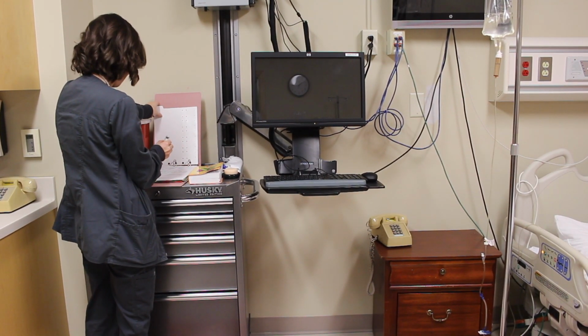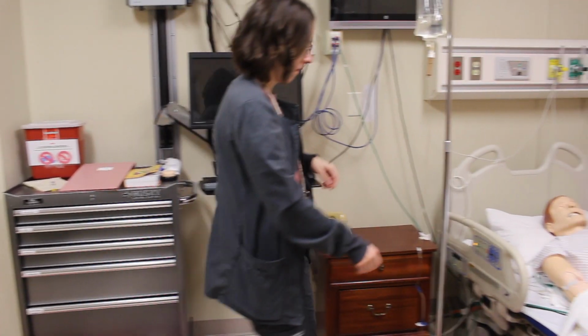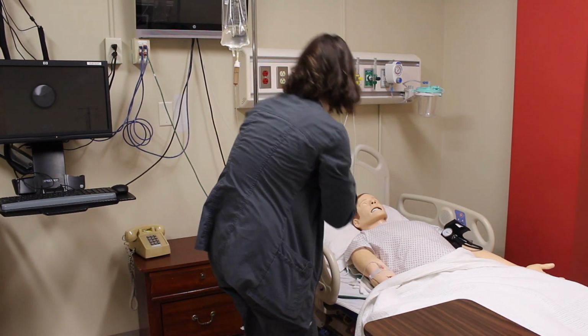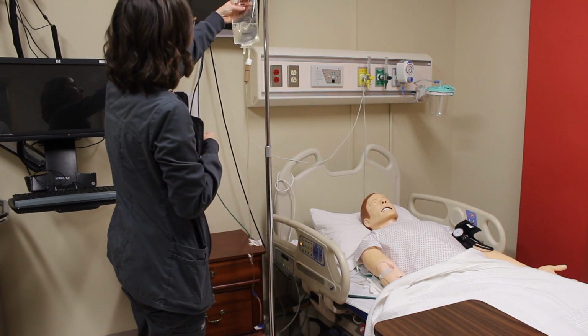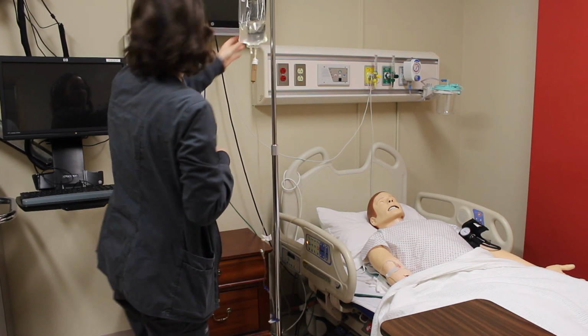Complete the 6 essential tasks. Identify the patient using 2 identifiers. Educate the patient about the medication. Check compatibility of the medication with existing intravenous solutions if they are currently infusing.